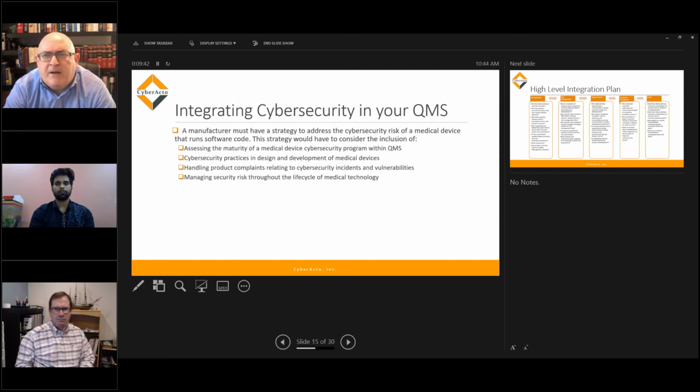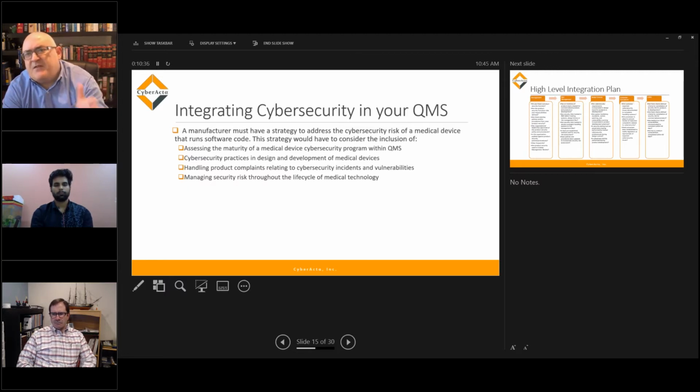And as we're going in, it's a key point. It's not necessarily covered here, but I want to make sure you're aware that more and more buyers are relying on or expecting to see a cybersecurity framework as part of this device process. Especially, obviously, the FDA is working on issuing what they call SBOMs or CBOMs, cybersecurity bill of materials, which in essence is a software bill of materials. And similarly in Europe, there's recent guidance from a procurement standpoint for hospitals or health clinics to evaluate cybersecurity as part of that procurement process. So it doesn't stop just with the FDA; it is slowly extending to the customer.